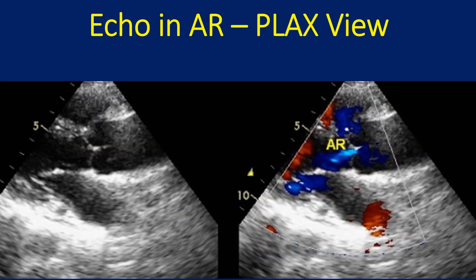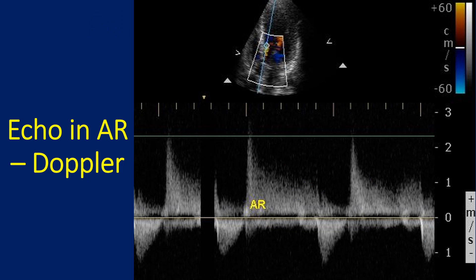The parasternal long axis view shows a small AR jet, which would be taken as trivial AR with no hemodynamic significance. The left atrium and left ventricle are not dilated. Trivial aortic regurgitation on Doppler interrogation from the apical 5-chamber view shows an incomplete jet, as obtained when the regurgitant flow is less, as in trivial or mild AR. The jet below the baseline represents forward aortic flow in systole, while the AR in diastole is seen above the baseline, as the regurgitant flow into the left ventricle is towards the transducer in this view.